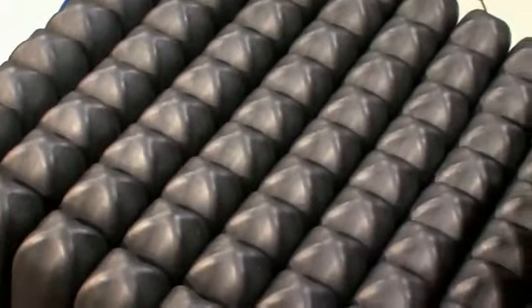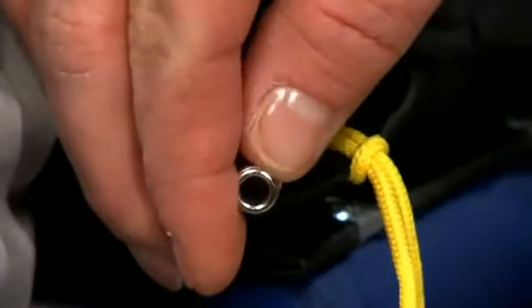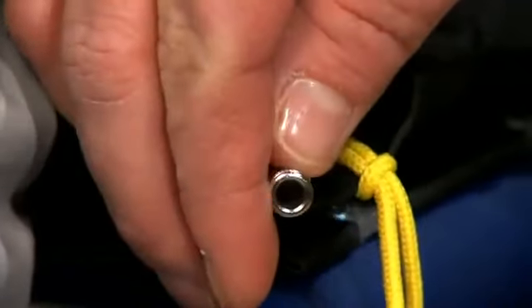Remember, the air must travel through the isoflow memory control, so you will do this in increments, closing the valve and giving the air in the cushion time to equalize to avoid letting too much air out of the cushion. Position the individual on the cushion in their desired posture and have them maintain this position while the air transfers through the isoflow memory control.